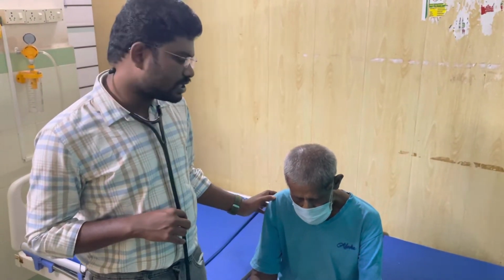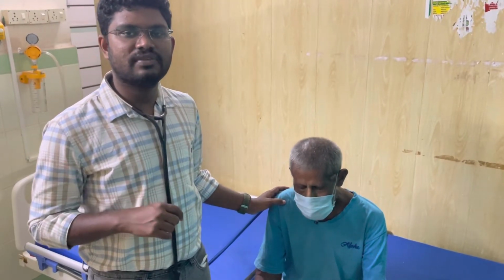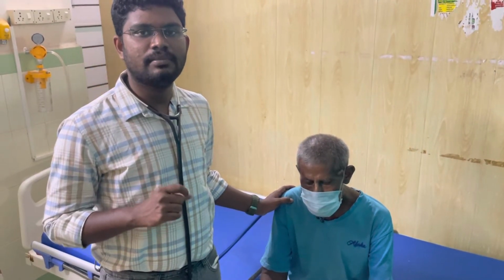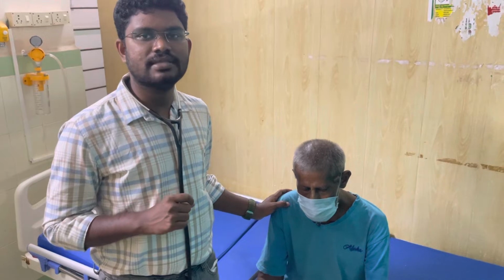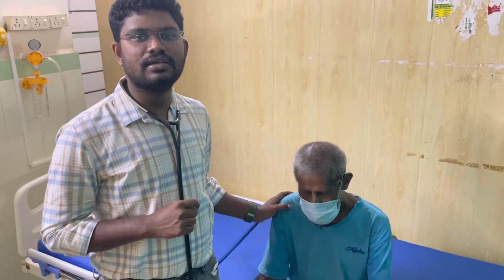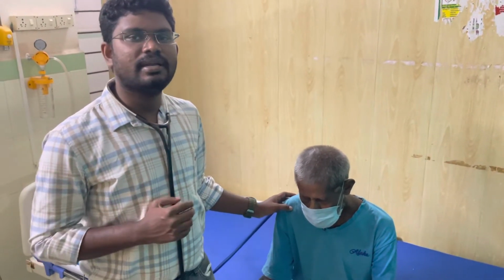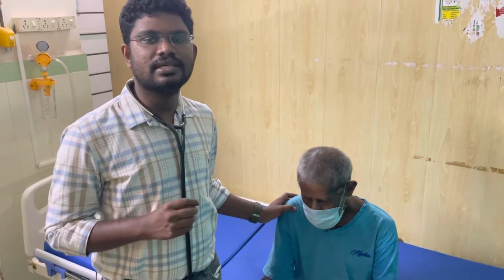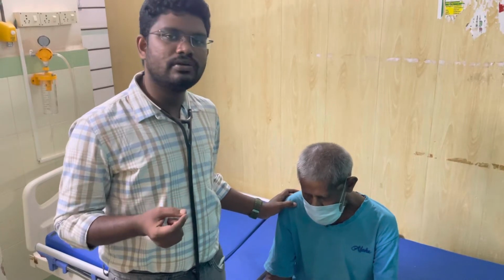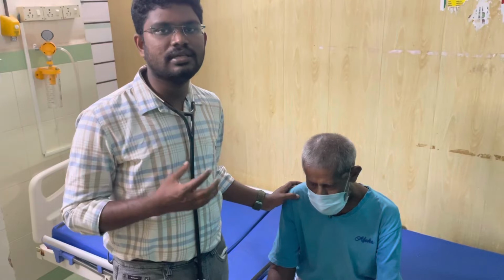This phenomenon is the Gallavardin phenomenon, where the murmur of aortic stenosis, that is, the ejection systolic murmur heard at the base of the heart, right second intercostal space, is conducted to the apex of the heart, which mimics that of the mitral regurgitation murmur. But the differentiating point is, in mitral regurgitation, the murmur heard at the apex of the heart is radiated to the axilla. Now we try to listen at the axilla to see if the murmur is present.